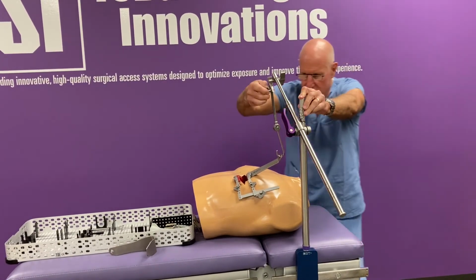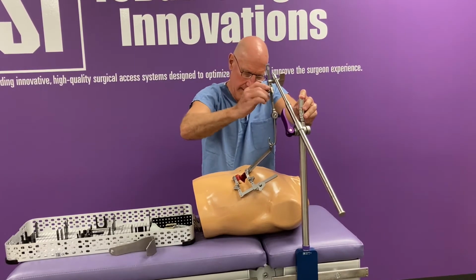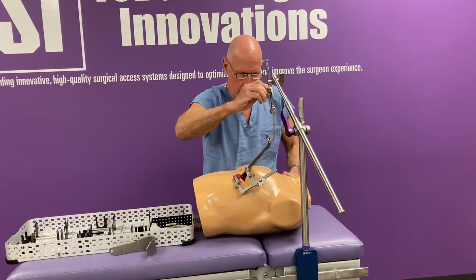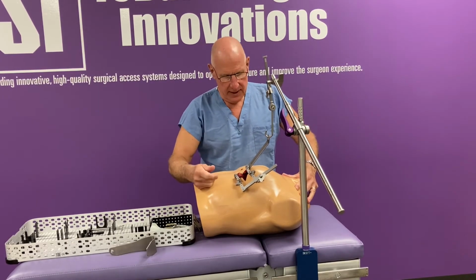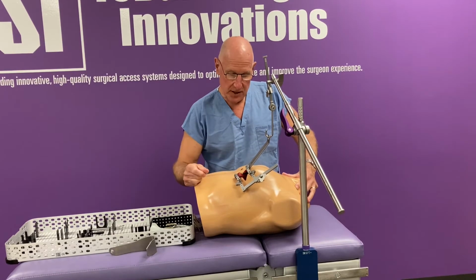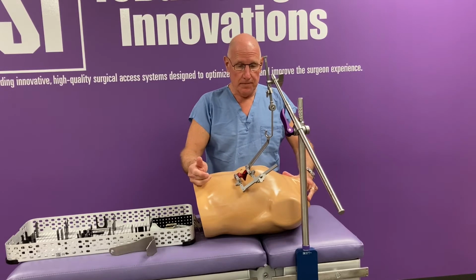And we're going to go ahead and use the retractor crank here to do so. See how that's lifting up like this? Now that's going to give us excellent visualization of the left IMA through this thoracotomy incision.